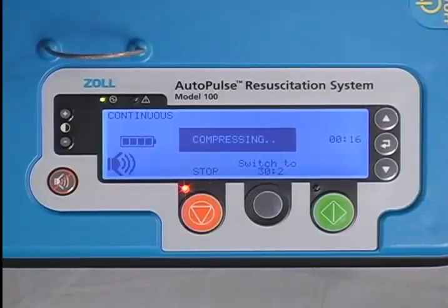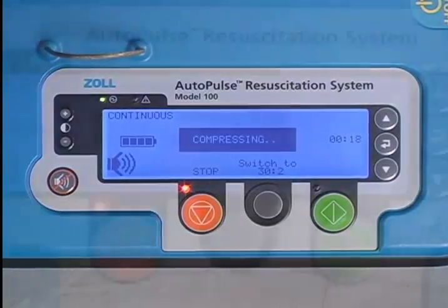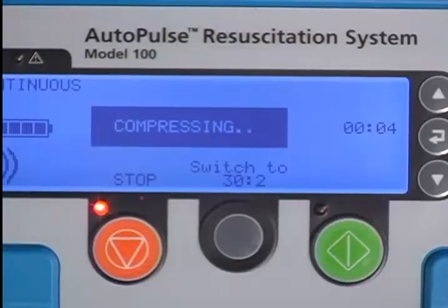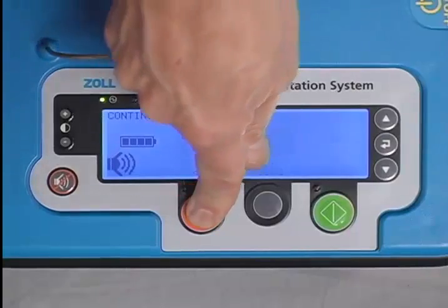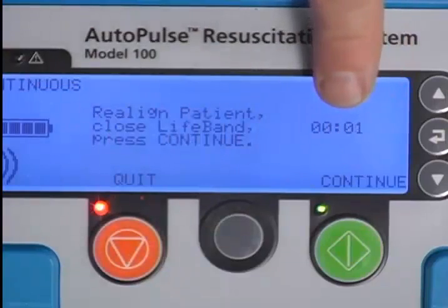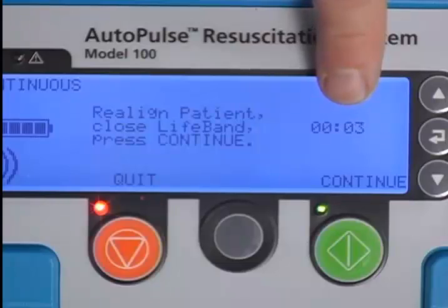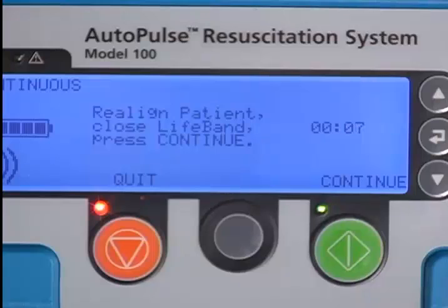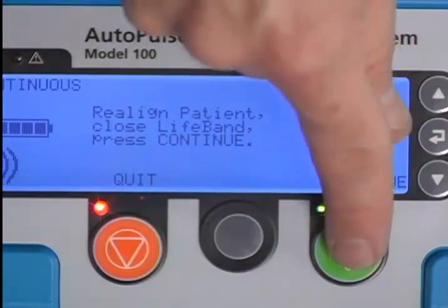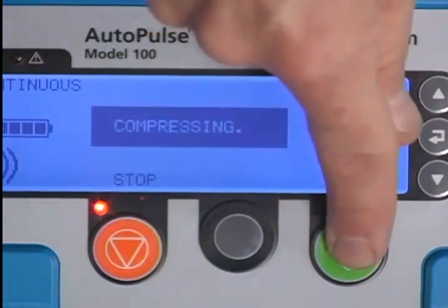The timer allows the user to see, in real time, exactly how long compressions have been underway and exactly how long the patient has been without perfusion. The timer records the elapsed time from the start of compressions to when they are paused. Once compressions are stopped, the counter is reset to 0 and immediately begins tracking no-flow time. The timer resets to 0 once again and begins tracking compressions once active Autopulse operation is resumed.